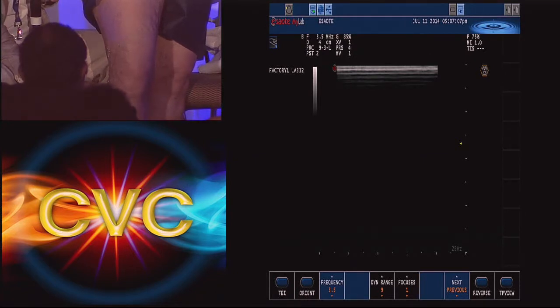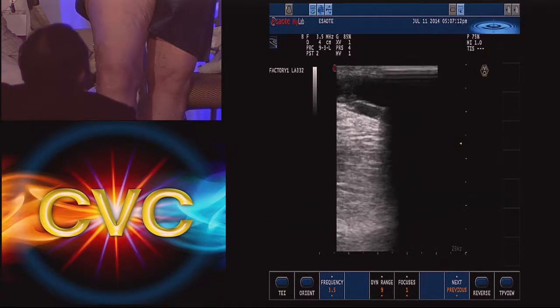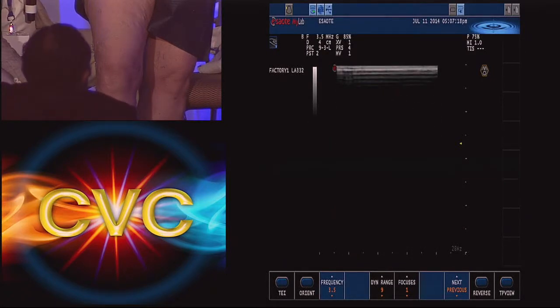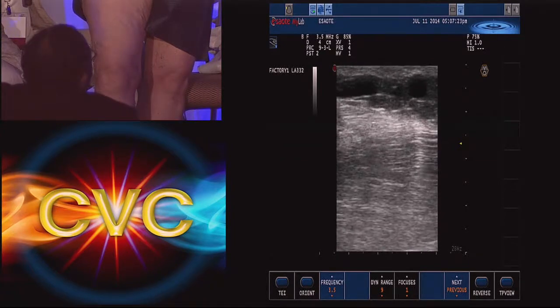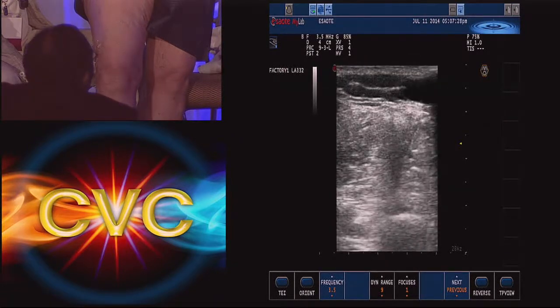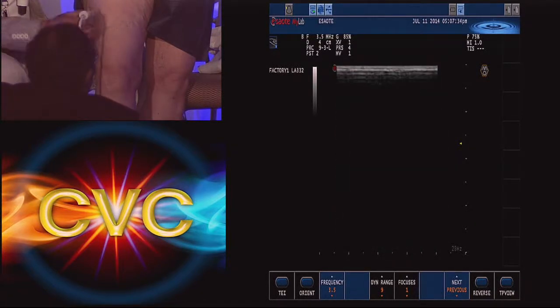Yeah, it wraps further down there, doesn't it? Yeah, it does. There you go. You can see it's boggy right up there. It doesn't project well on the screen higher up, but I can follow it down. And I can actually feel right here, she must have a, and you can see it right there. Yep. And goes down further. But if there was no reflux down here, when you shut this, this will all thrombose. And then you can either do foam or phlebectomy at the same time. I do less phlebectomy than I used to before.